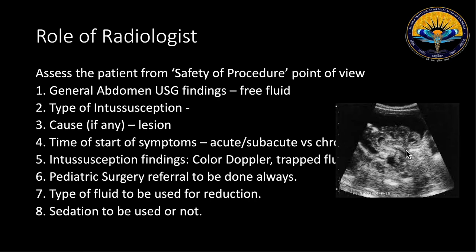However, in case of an ileo-ileocolic intussusception, there is a frond-like ileum that can be seen within the large bowel. It has been found that the hydrostatic reduction rate for ileo-ileocolic intussusception is approximately 10%, while that of only ileocolic is between the range of 80 to 95%. We have to also find out the cause, if there is any lesion or a leading point, because then we have to send the patient for clinical re-evaluation. I will show you that treatment algorithm in the last slide.